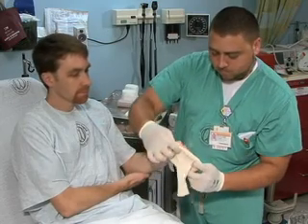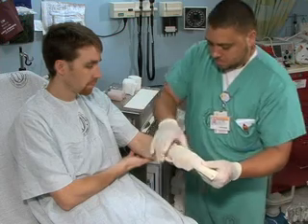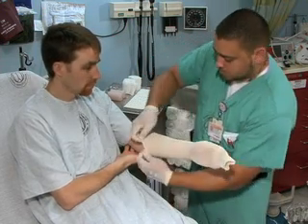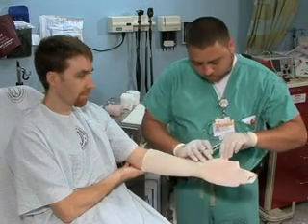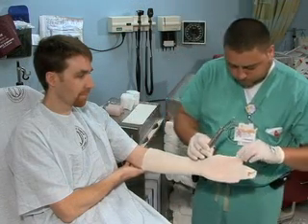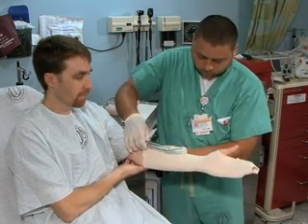This section demonstrates the application of a volar splint to an upper extremity. Apply the stockinette to the extremity, avoiding wrinkles and using sufficient length to extend 10 centimeters beyond each end of the splint. Use scissors to cut an opening for the thumb. Cut a small hole in the stockinette where it lies across the base of the thumb and then pull over the digit to prevent wrinkles.